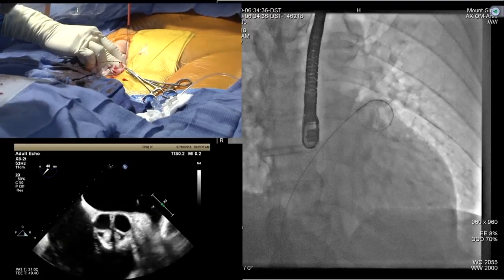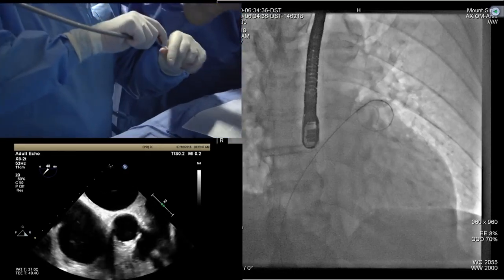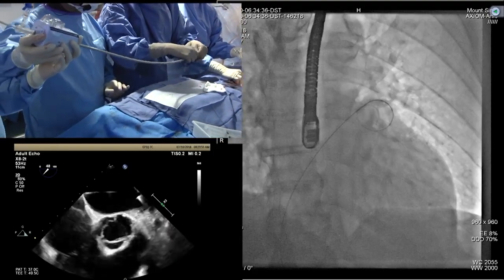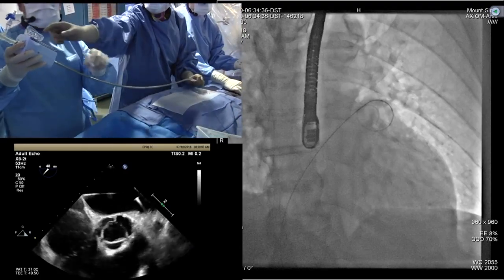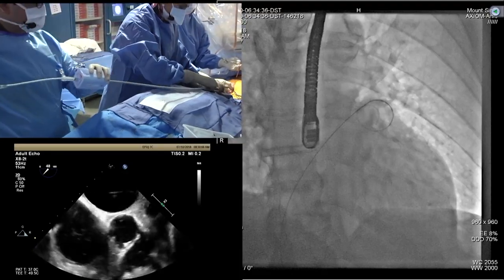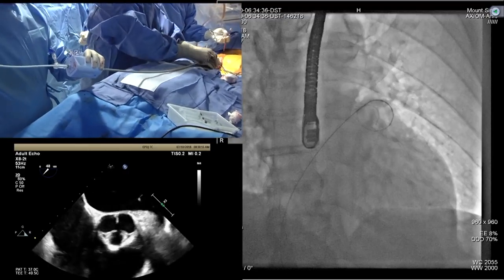Okay, now we have our steerable guide. Very important with the steerable guide are the knob movements. The other thing is you need to activate it. Take a wet gauze. This whole thing needs to be activated so it is very slippery. So the knob has to be neutral now. Not positive, make it negative. Negative. Go negative. I think that's very important, so that it makes the insertion easier when you take all the plus out and put it in neutral position.